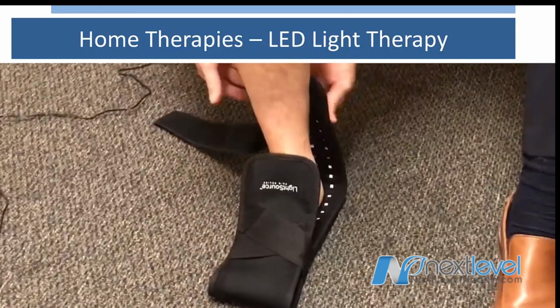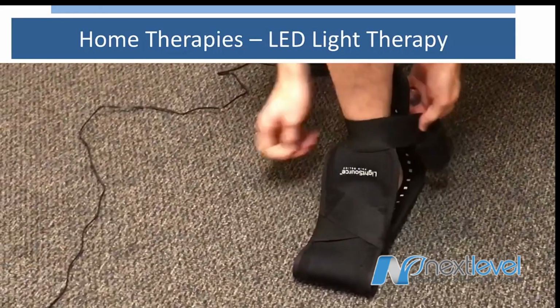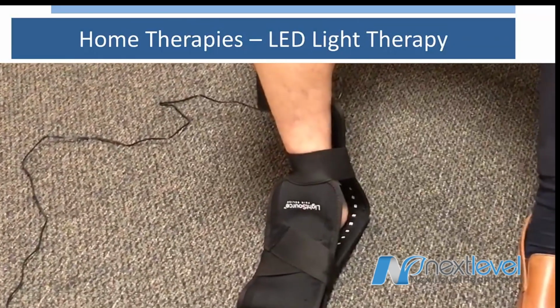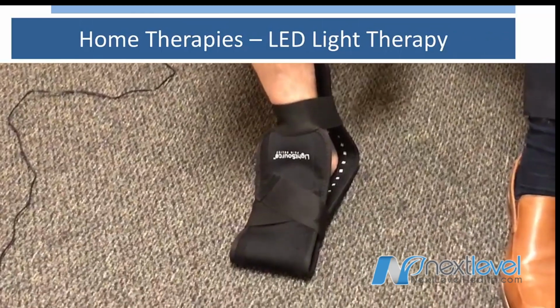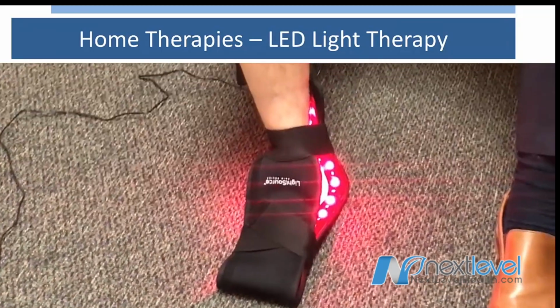Bring the back piece up. You should have a piece of Velcro for the back, and that will secure it to the back of your ankle. Press and hold the power button until the lights turn on. Once the lights are done, after 20 minutes, remove them, put them on the other foot, and repeat the process.